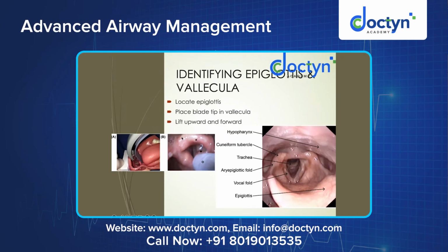If you see this image, the star which is there is the epiglottis, which is lifted over the laryngoscope blade. You see the vocal cords here. These are the false vocal cords which are shining. Inside there is a white slit-like structure. These are the true vocal cords. Across these vocal cords, you will have to insert your tube so that the ventilation is established.